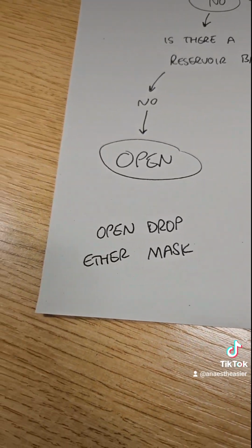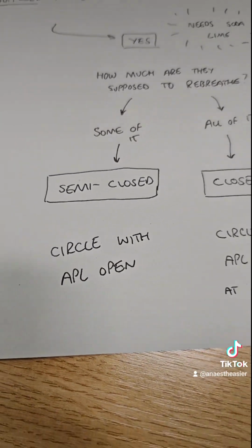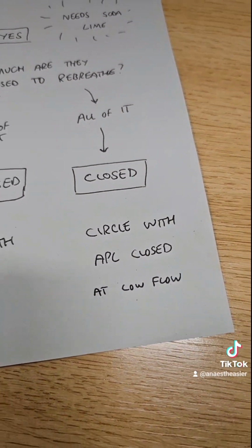And those are the 4 examples you should give: the open drop ether mask, the Mapleson circuits, circle with the APL valve open, and the circle with the APL closed or at low flow.